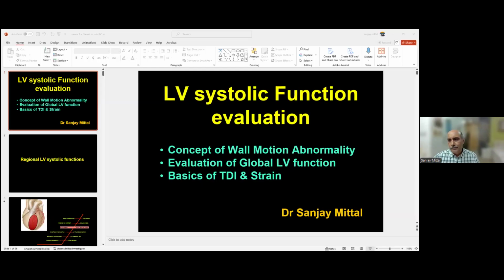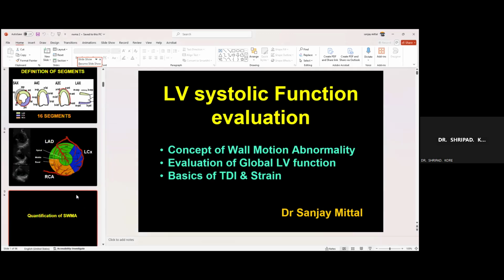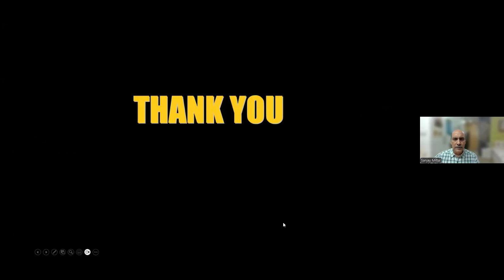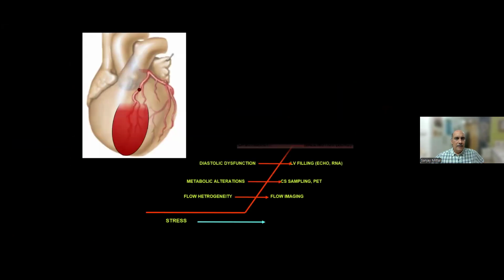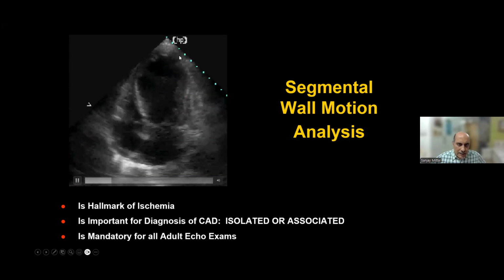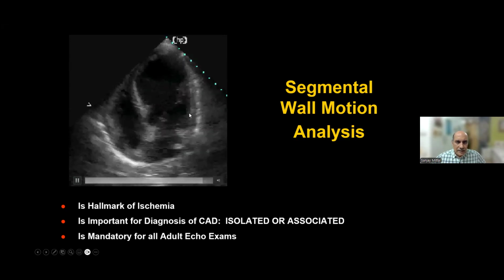I think you have to see those muscle segments very clearly. Normal segments are something which I'll try to show you that example again. Are you able to see the slides again? Yes, sir. So this is something which I showed you to begin with. So this is what it is. You see this fibrous tissue here? This is the muscular tissue, right? And here you can't see any muscular tissue. This is all scar, right?